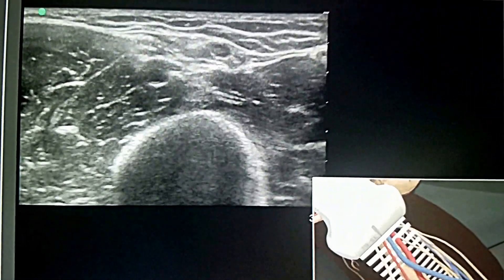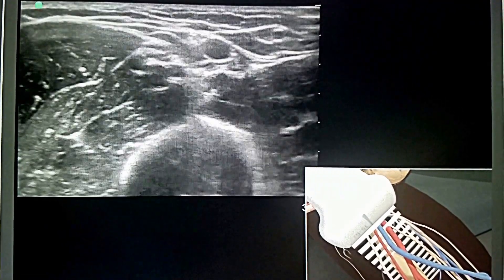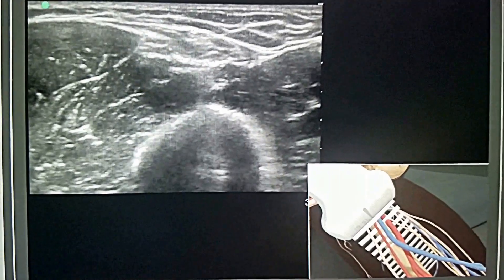A linear array transducer with a venous exam type is used to perform an ultrasound-guided insertion of a peripherally inserted central catheter via a transverse approach.